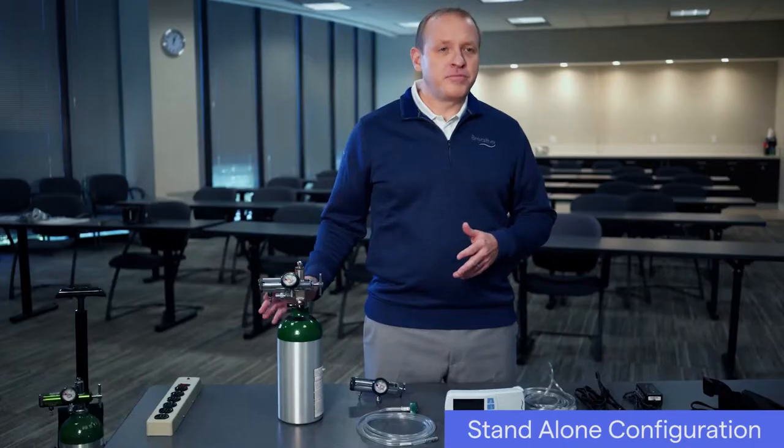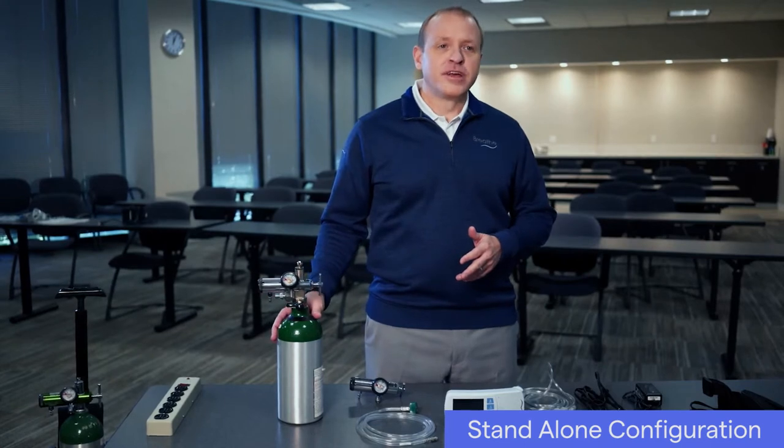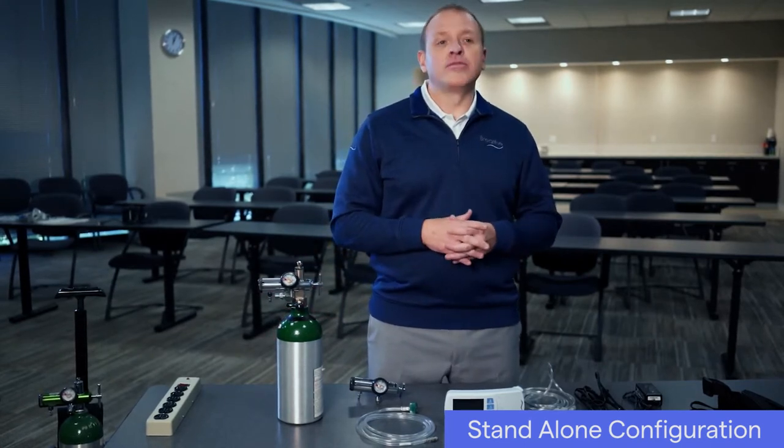In this video, I'll show you how to set up the Life 2000 ventilation system in the stand-alone configuration. The Life 2000 system can be used in different configurations of operation as patient needs change. In the stand-alone configuration, the Life 2000 ventilator is connected to a 50 psi oxygen cylinder, enabling patients to ambulate outside the home.